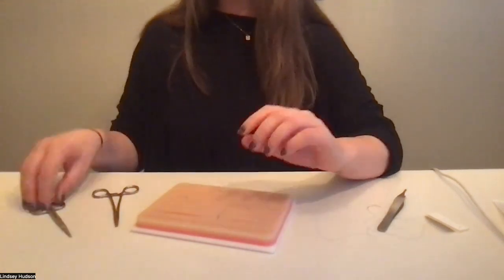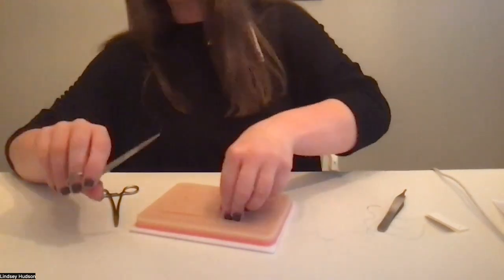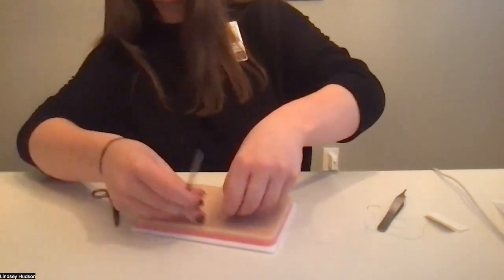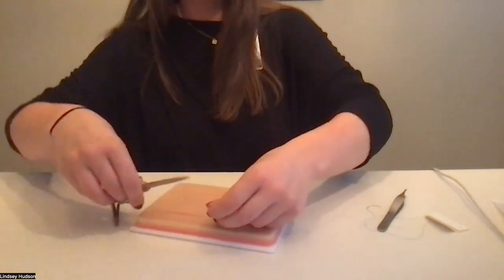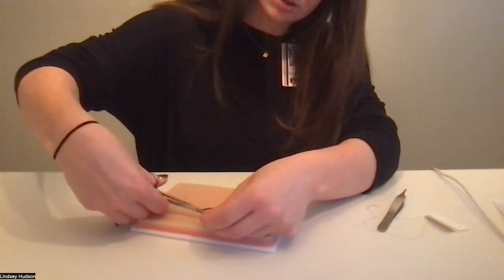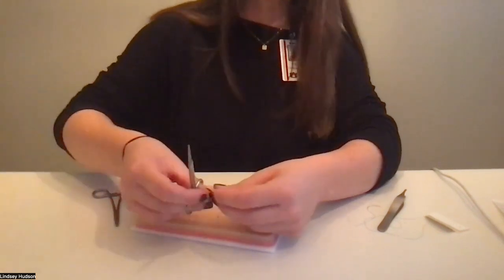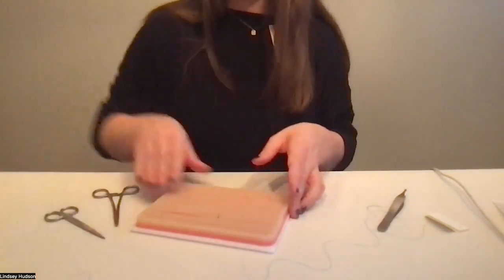You're then going to take your scissors, and you're going to cut this excess so that it's not poking your patient and not getting in the way of your other sutures. You're going to cut those at an angle so that they're the same size as well.